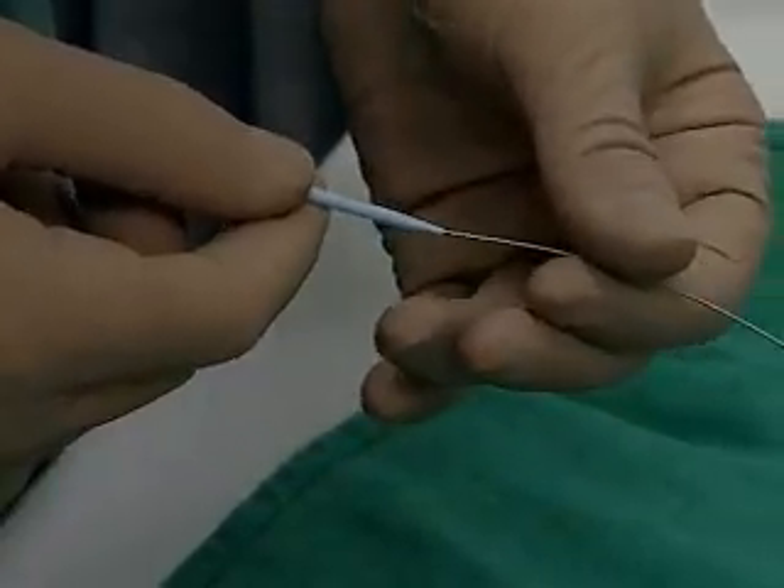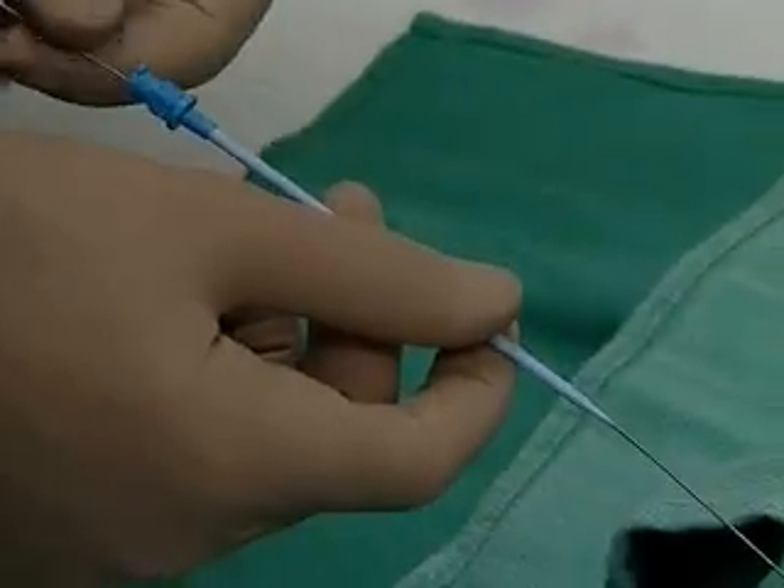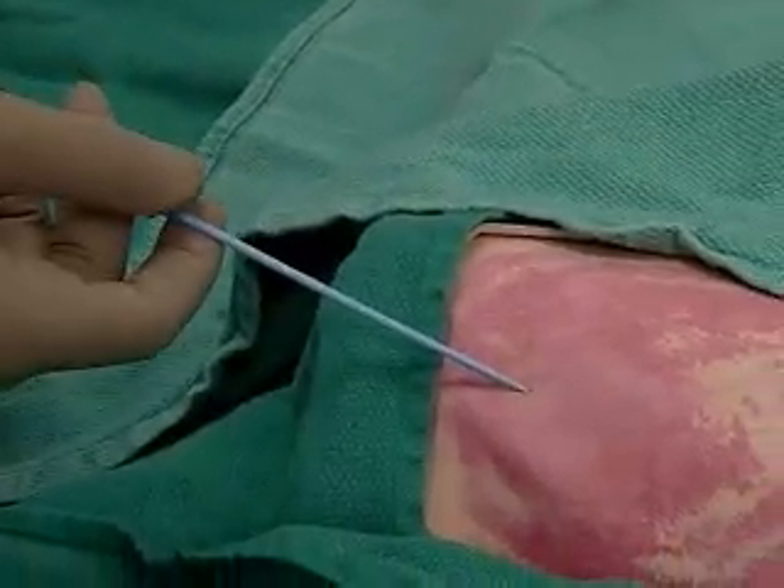We advance the dilator over the wire, advancing carefully to dilate the soft tissue, still holding the end of that wire with one hand.